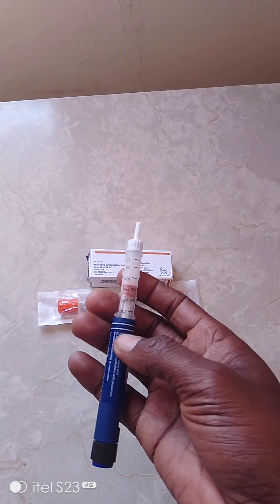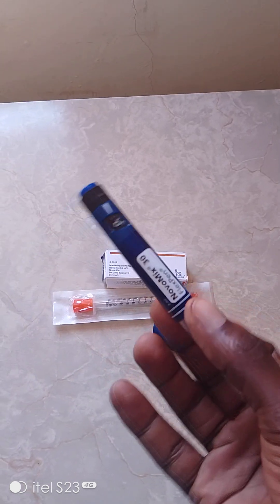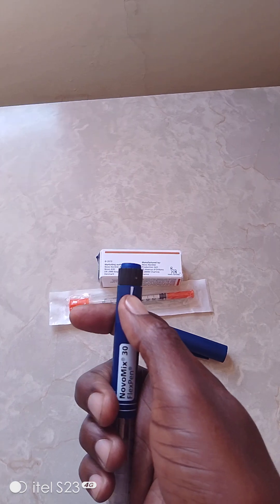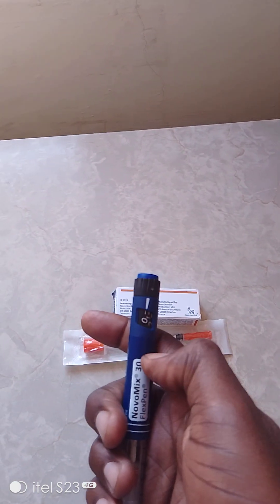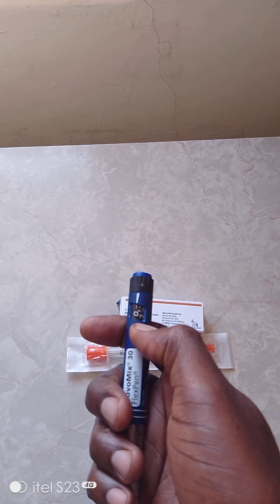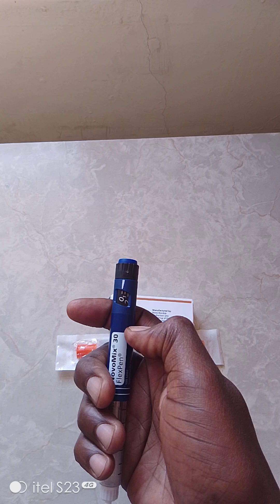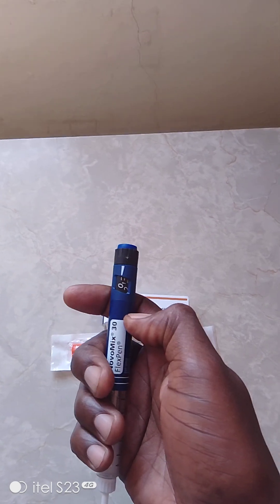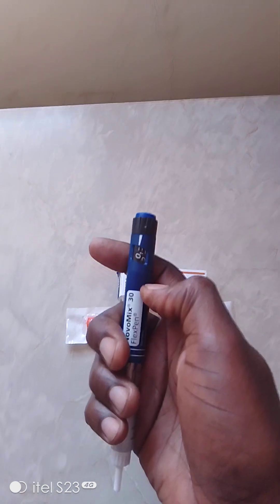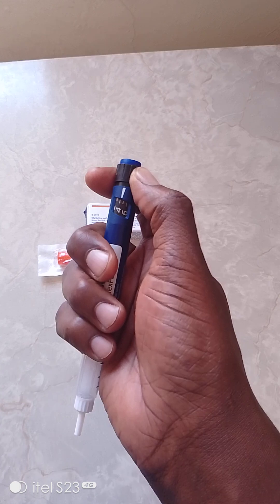Most people wonder how this flex pen works. It has this part here - a pointer to regulate how much insulin should be given. This is more like a counter where you see the number zero. This counter will give according to what the doctor prescribed for you.